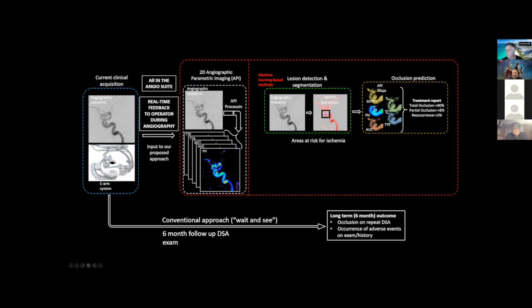And then not only does it find where it is, it segments it out, which means it takes only the area of the aneurysm and extracts those parameters, and then it makes a prediction. Today my talk is about how we do this with AI, but I also want to show you evidence that all this data is supported. You cannot go to the AI and expect it to do its magic and make a prediction that doesn't match our understanding, our scientific understanding, of the processes associated with this particular disease.